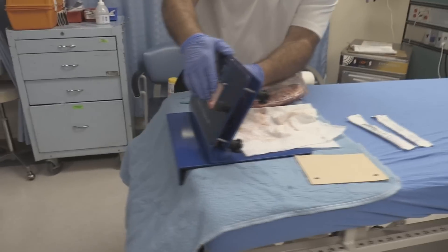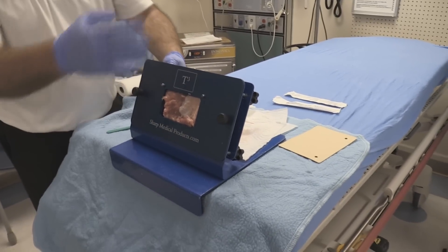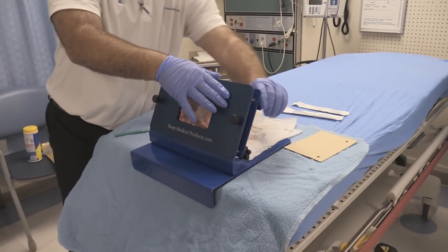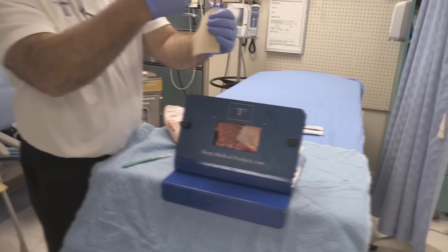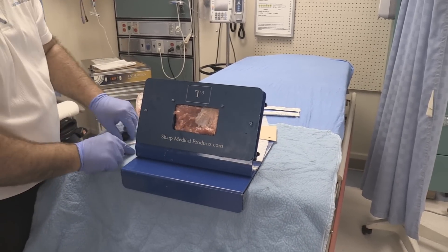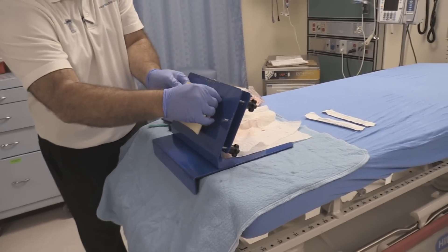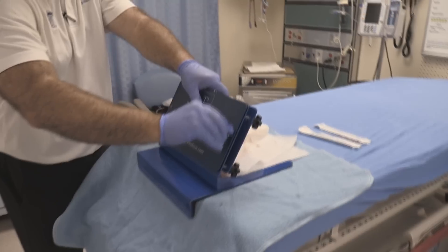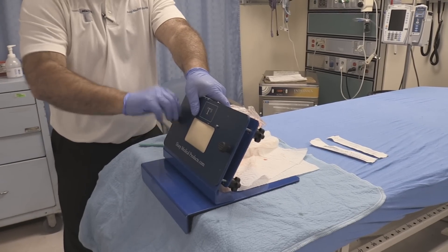Now I've got it secured in place. I'm going to tighten it down so the rib holds. The ribs can go vertical or horizontal — you can position them whichever way you want. Now we're going to put on a skin-type cover to replicate making a skin incision. We remove the front plate, lay the skin in position, put the plate back on, and the skin is secured. We want to replicate having skin right over the top of the ribs and muscle.